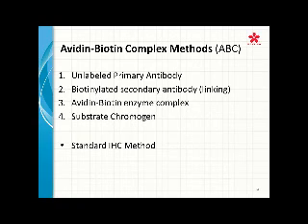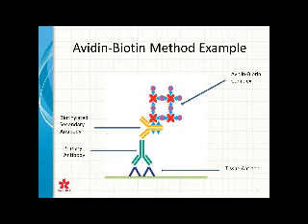It should only be very clean in the background, specific for one target cell. So because avidin and biotin created the non-specific staining, and you had to add another blocker to prohibit that non-specific staining, another detection kit was developed to minimize the non-specific staining.